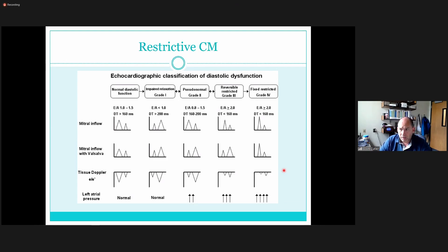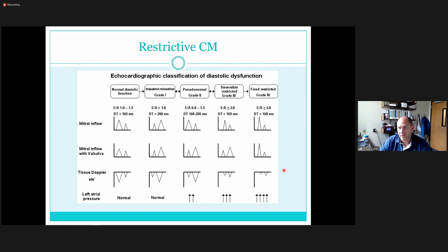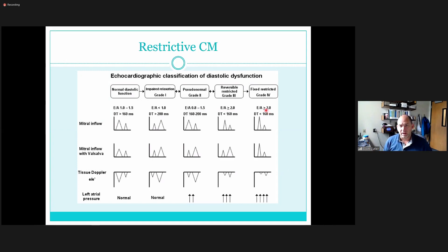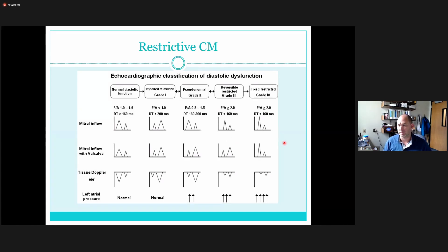When the waveform is very steep and very tall, you're thinking restrictive for sure — those stand out quite significantly. Then of course we measure those and look at left atrial pressure, which will be significantly elevated. Biatrial enlargement comes into play visually as well. The numbers of restrictive cardiomyopathy distinguish it — make sure you get all the appropriate measurements and comparisons: tissue Doppler, pulmonary venous flow, and so on.